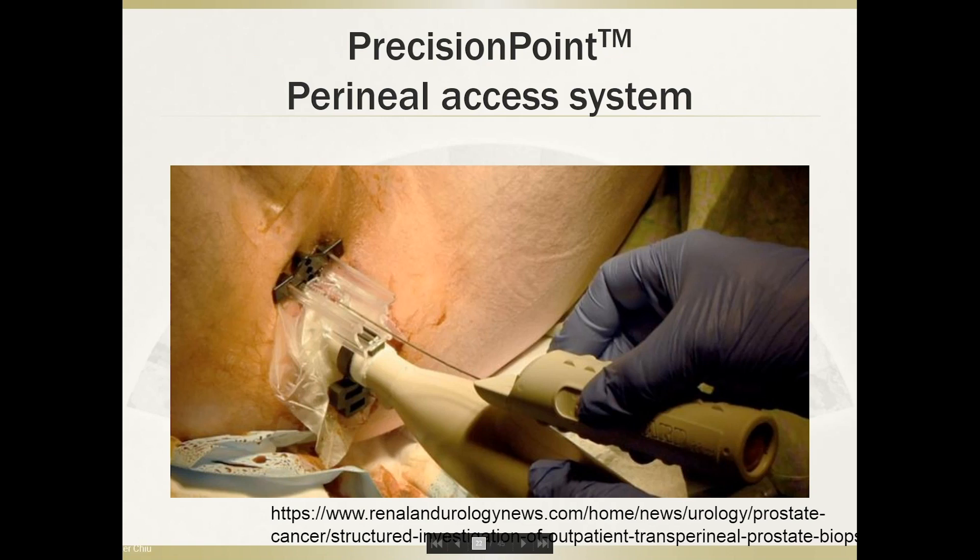This is the Precision Point perineal access system, which is a very nice system that shortens the learning curve and enables single-puncture transperineal biopsy under local anesthesia. Unfortunately, in my institution we don't have the resources to purchase this expensive instrument, so we still use the metallic trocar as our main approach for transperineal biopsy under local anesthesia.